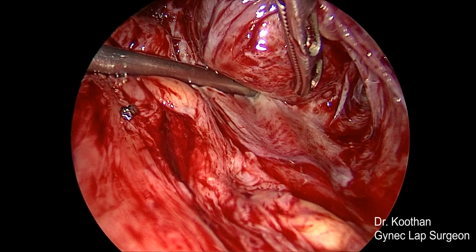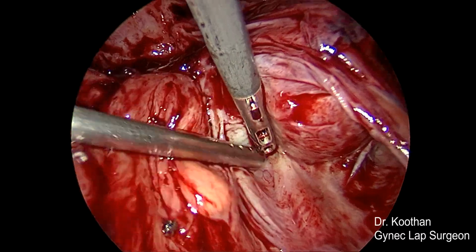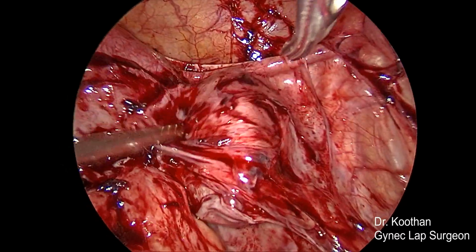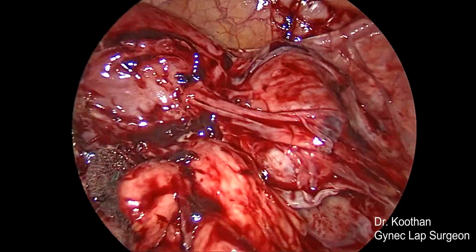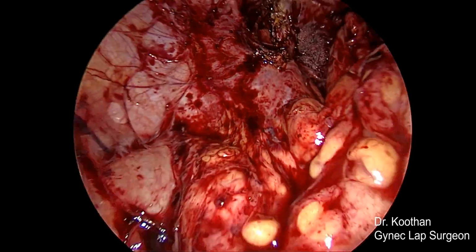So you can see the adhesions between the posterior pelvic peritoneum and the Pyosalpinx. So we are now trying to get a plane between the ovary and the peritoneum.